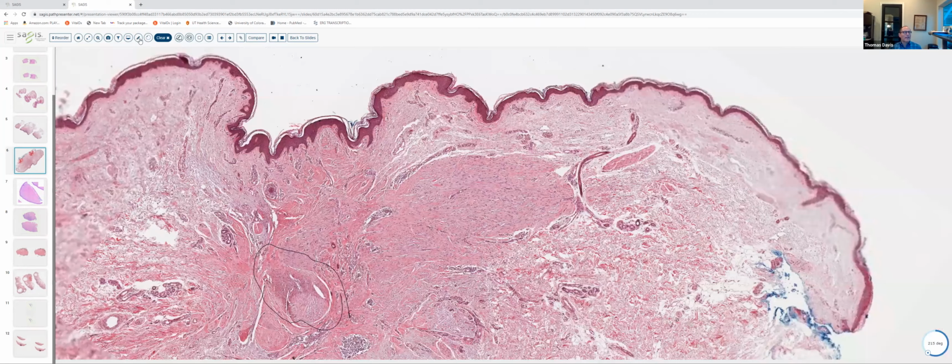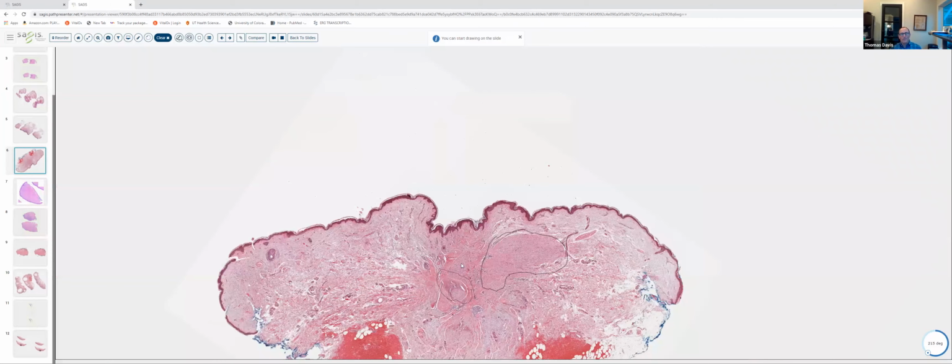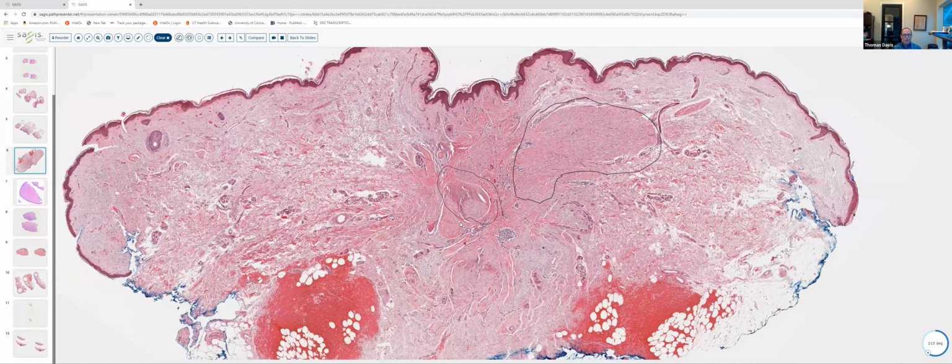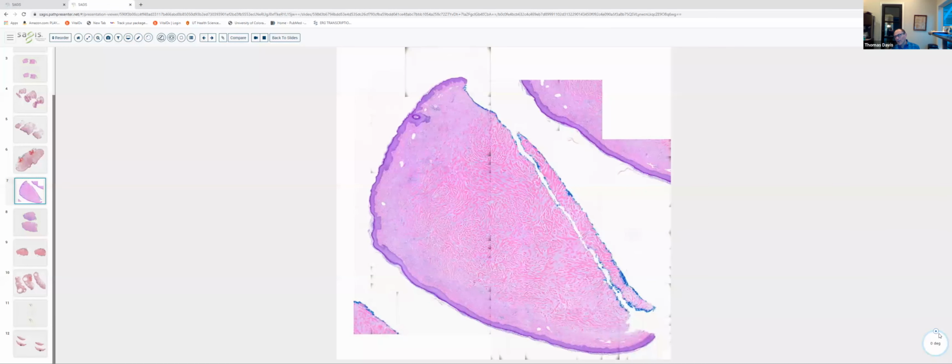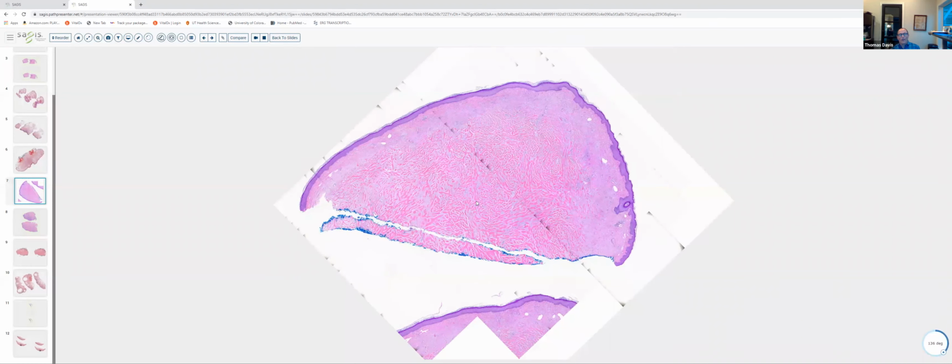And anytime we get what looks like a scar, but is characterized by nodules and whorls of fibroblasts, that's what defines a hypertrophic scar. So we're kind of looking at the spectrum of scars here. First one, parallel fibroblasts east-west with north-south blood vessels: scar. If we begin to see more of this nodular arrangement, we've got a hypertrophic scar. And then finally, our next slide, a dome-shaped nodule. And this is kind of at the other end of the spectrum.